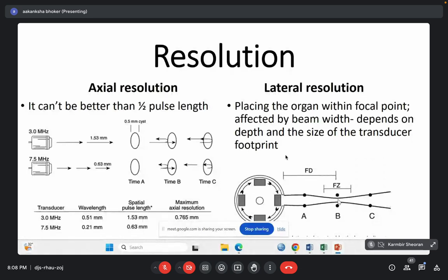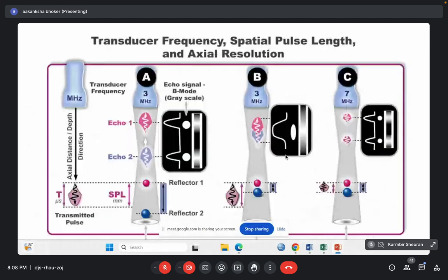तो जितनी narrow हमारी beam की width होगी उतने ये दोनों structures उससे अलग अलग strike करेंगे, and they will be resolved as separate. लेकिन अगर हम इसको दूर far field के अंदर रखेंगे beyond focal spot, then they will be identified as similar. So here is one pictorial representation to understand these.